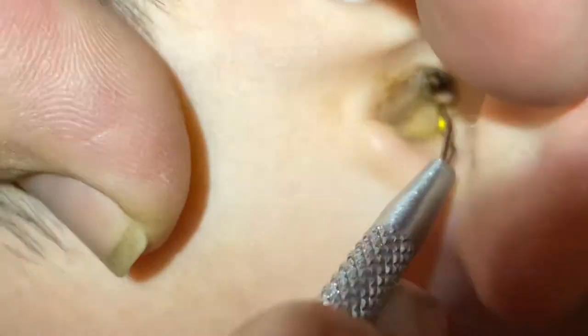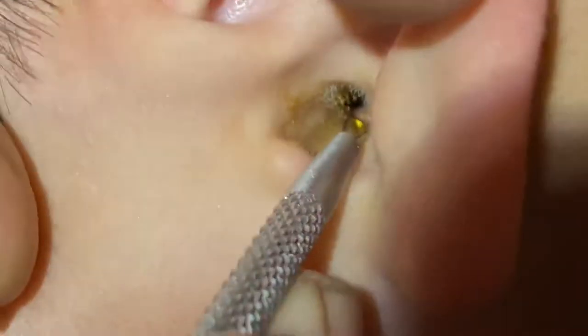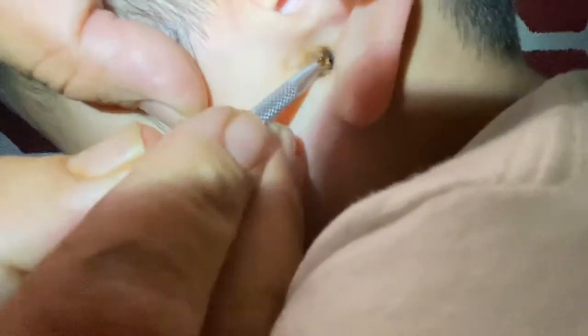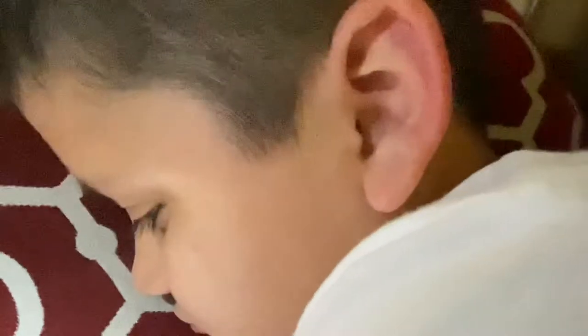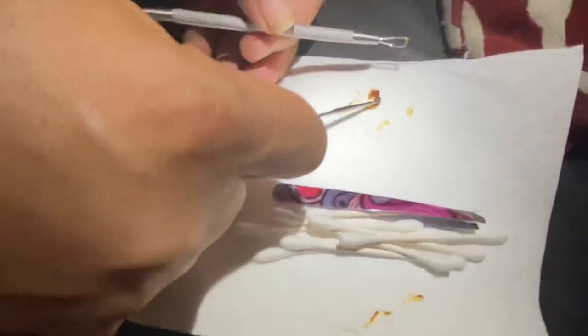Look at that — okay, this is kind of gross. I want to see one side. Just a big one. Can you move? Yeah, a little bit, not too much. Okay, it's not too much, just a little bit. See where I put it here? That's gross — look at this big one, big and chunky like tamarindo candy.